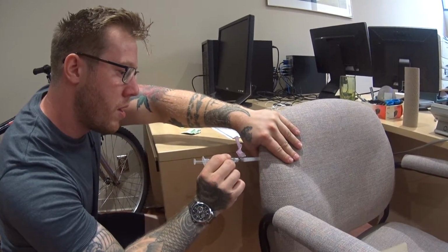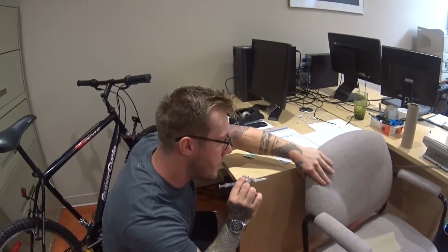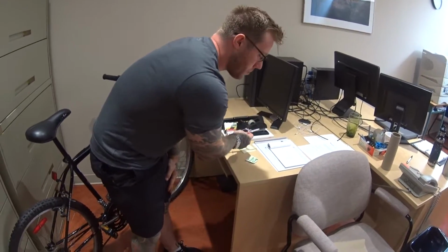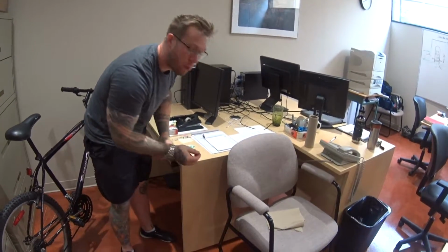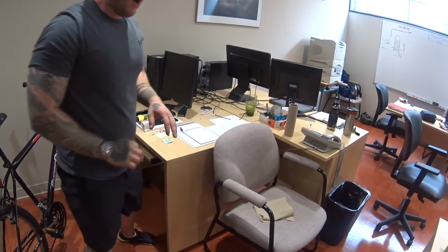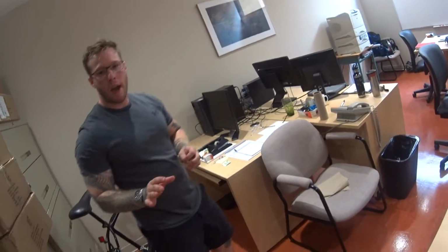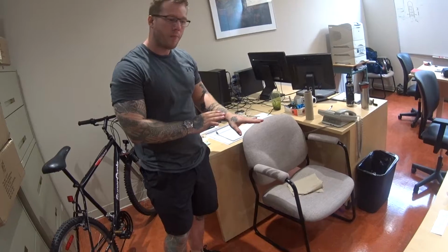I'm going to remove the needle at a 90-degree angle, the same angle I came in at, and dispense the needle into the sharps container right away. I'm going to get Mr. Milton a cotton swab or another alcohol swab to wipe away any blood that's there, and put a Band-Aid over it. I'm going to ask him if he's doing okay, if he has any concerns. He's okay, and I'm going to come back in 15 minutes to check on him just in case.